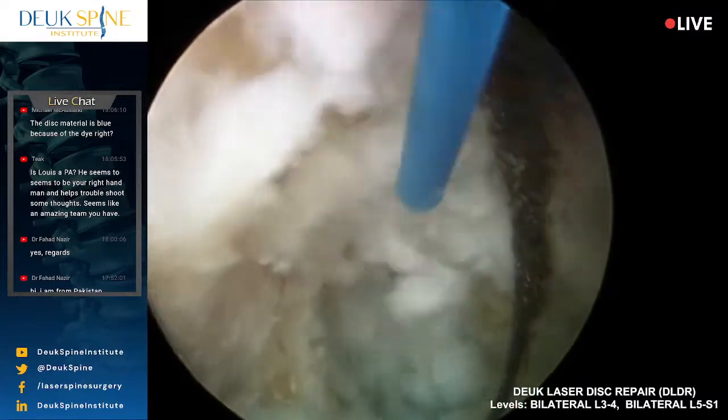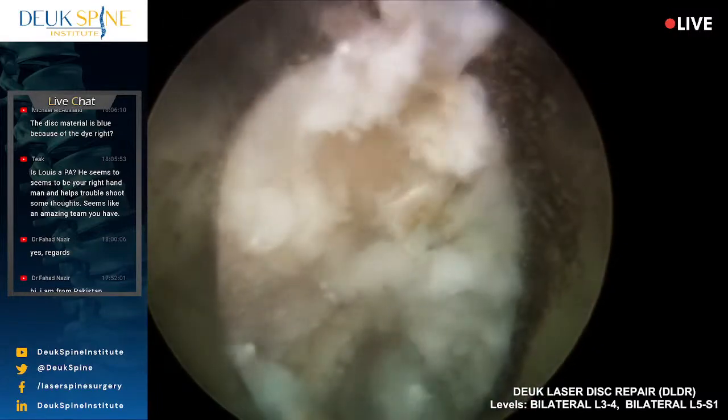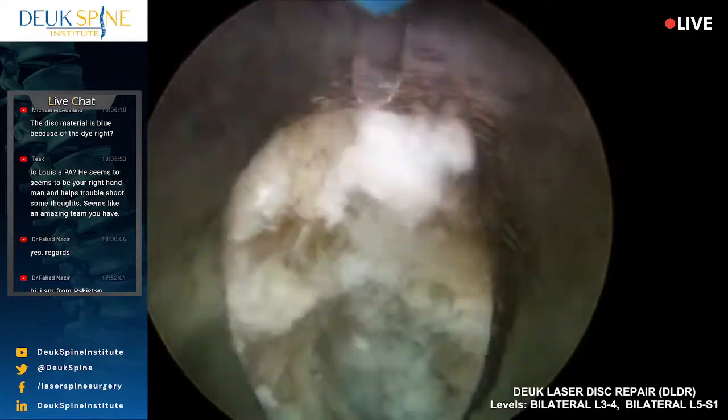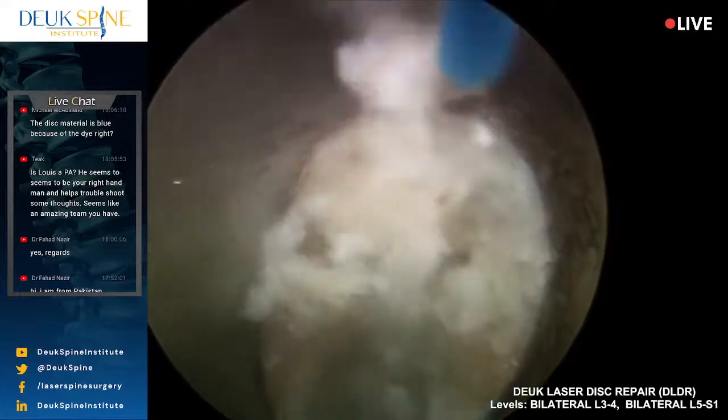Just about done. We still have the last disc to do. That looks pretty good.